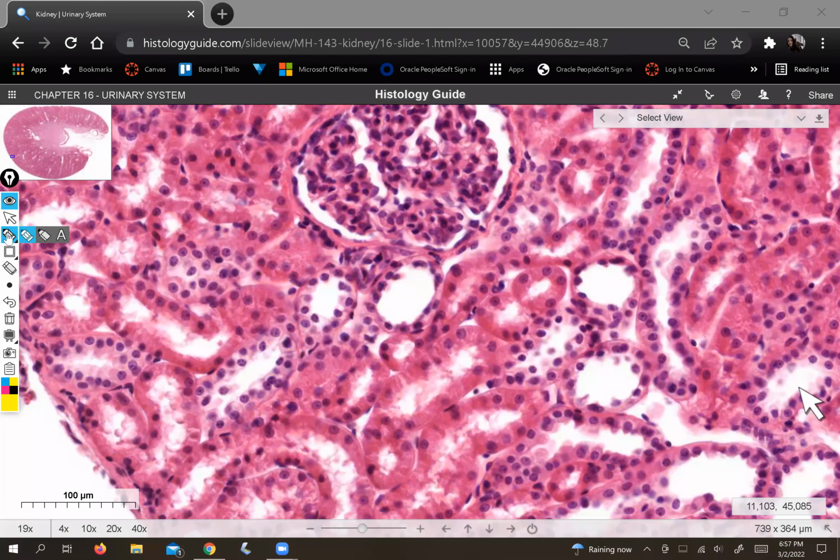And then the stain, eosin, tends to preferentially stain PCT cells. So we're looking for tubes with a messy, disorganized apical surface due to the brush border, and tubes with cells that are pretty pinkish red. So based on that description, what you'll find is there's a lot of tubes in this field of view that fit that bill. So let's start circling some.